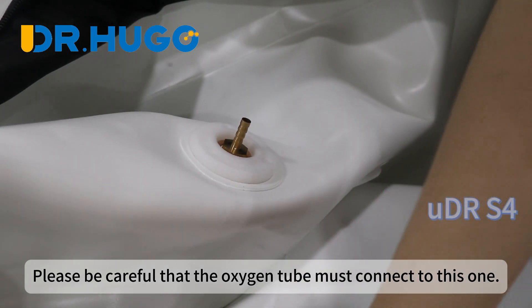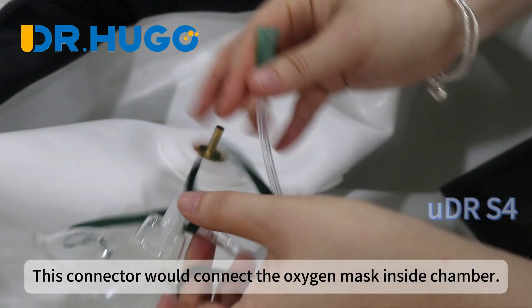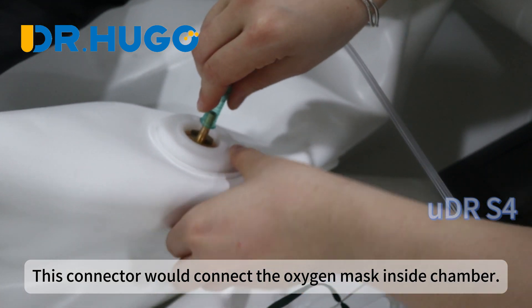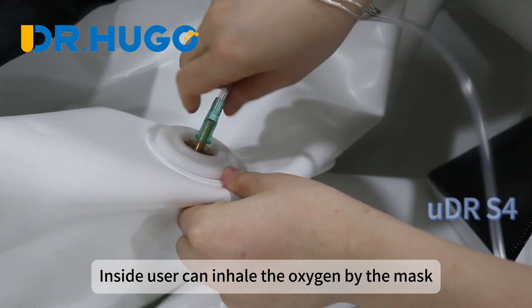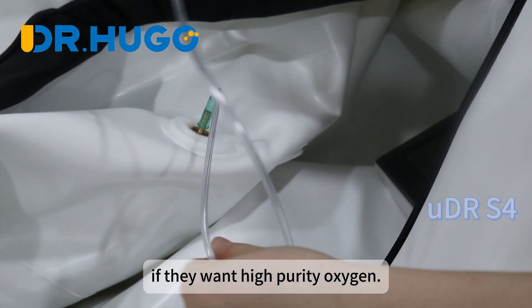Please be careful that the oxygen tube must connect to this one. This connector connects to the oxygen mask inside the chamber. Inside users can inhale the oxygen by the mask if they want high purity oxygen.